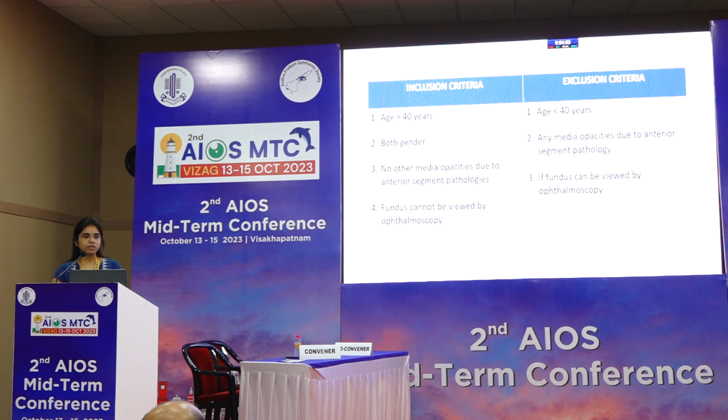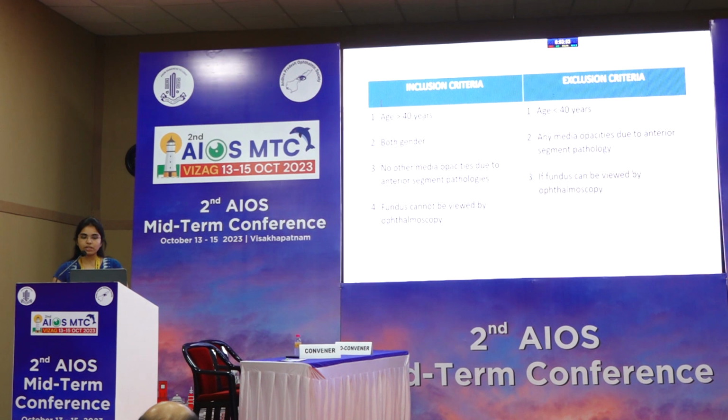Inclusion criteria were age more than 40 years, both genders, and no other media opacities due to anterior segment pathologies. Fundus cannot be viewed by ophthalmoscopy. My exclusion criteria were age less than 40 years, any media opacities due to anterior segment pathology, and if the fundus can be viewed by ophthalmoscopy.